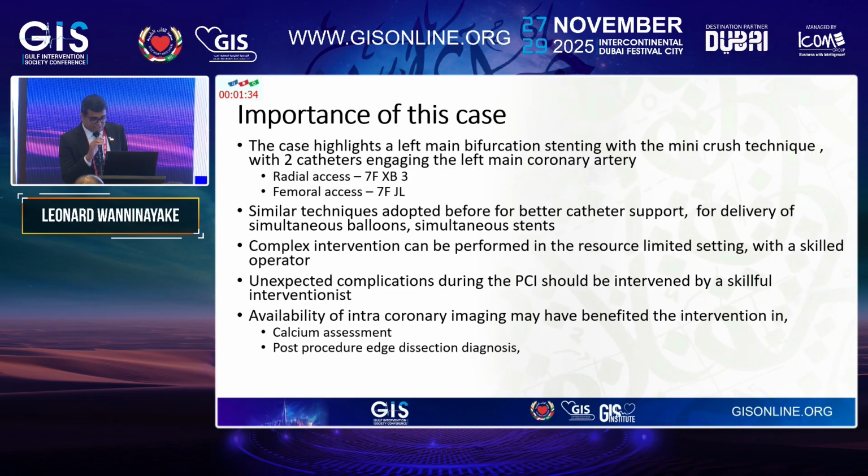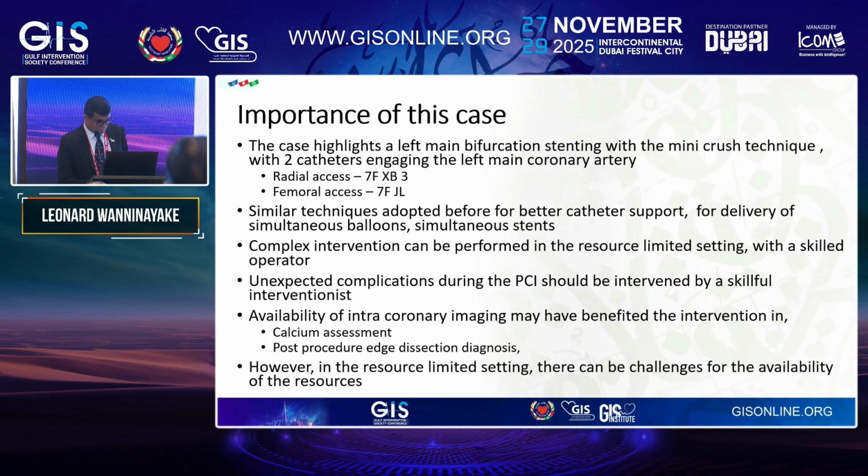One thing was that intracoronary imaging, if it had been available to us at that point, would have been helpful in the initial calcium assessment as well as in the detection of complications such as the post-procedural edge dissection that we noted at the end of our procedure using the cine images. However, in resource-limited settings like Sri Lanka, we will have to continue to face these challenges and perform complex cases.